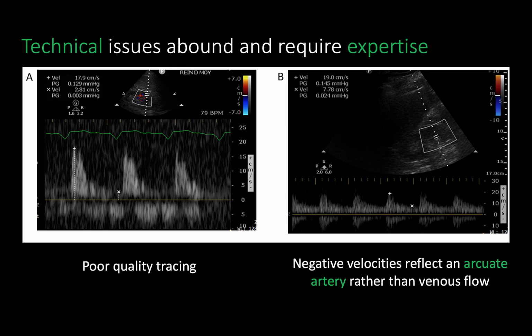Furthermore, intrarenal Doppler assessment usually becomes more challenging in the context of shock, when renal perfusion is impaired, or when significant severe acute kidney injury is present. Success rate may vary from 70 to 90% in critically ill patients, even in experienced operators.